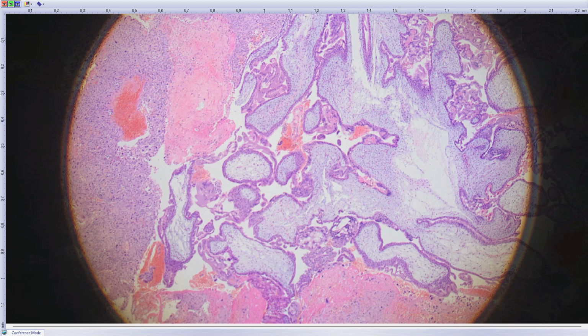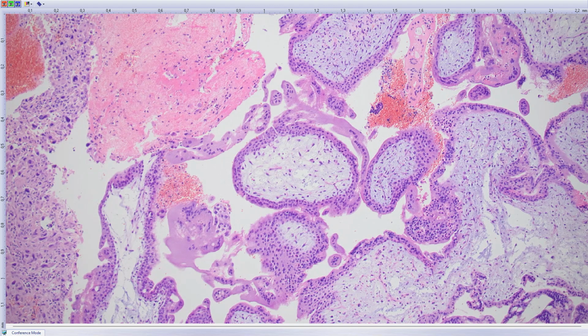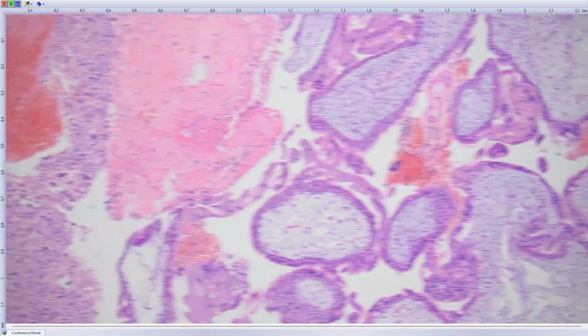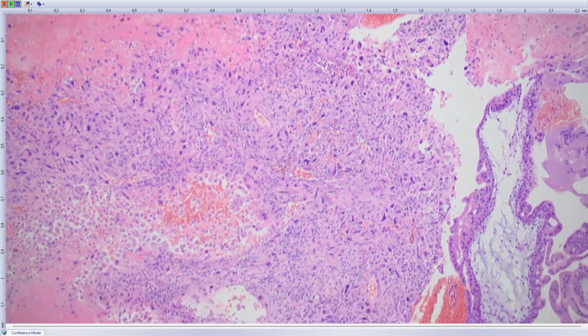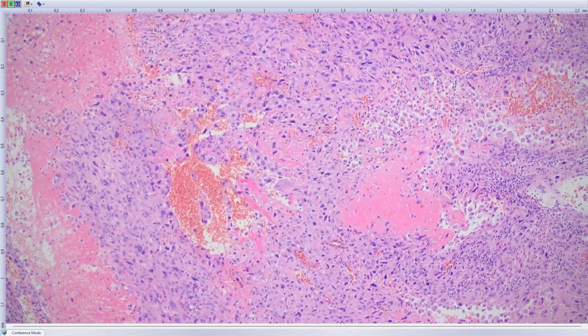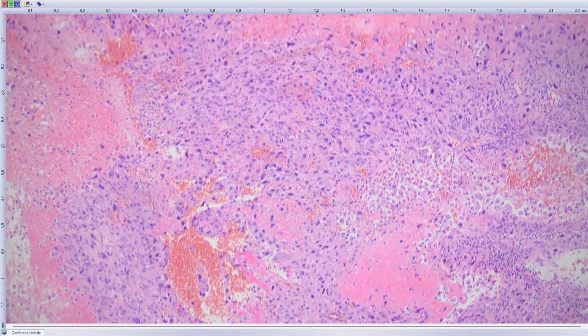But for the diagnosis of choriocarcinoma, I think the most helpful fact is that this is a non-molar pregnancy. As you can see here, there are normal chorionic villi without atypical proliferation of trophoblasts, which is one helpful sign. There is no need to focus only on the neoplastic lesion to decide what type of neoplasm this is. So non-molar pregnancy together with levels of human choriogonadotropin, which were low in this patient, so not alarming for the diagnosis of choriocarcinoma. And third, you will have to focus on the morphology and also immunophenotype of this lesion.